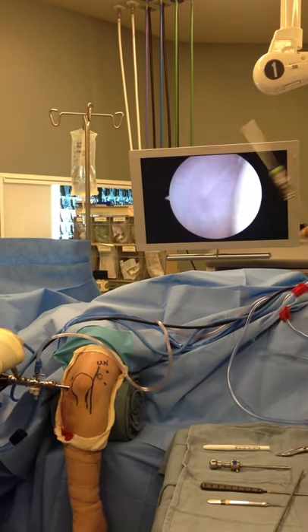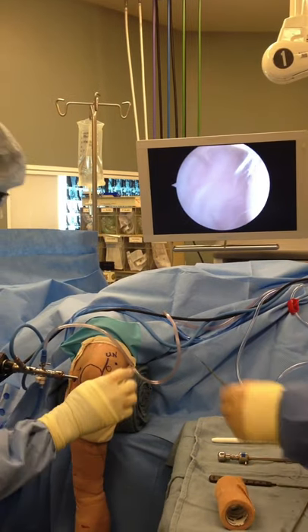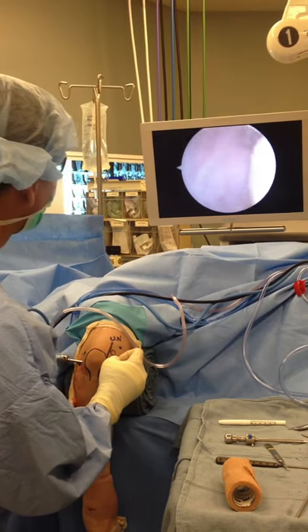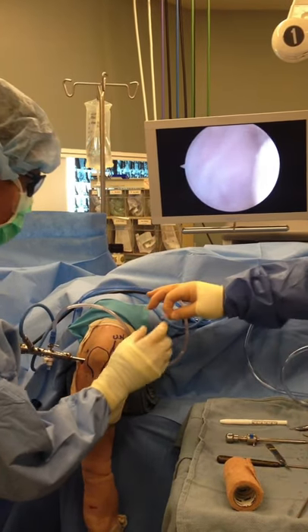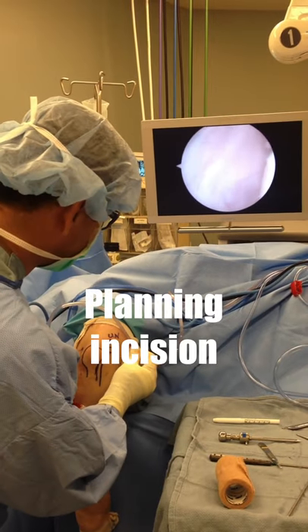Okay. So now I'm going to establish my portal on this side. And you have a spinal needle, or sorry, just a regular needle. No more fluid for injection right now.